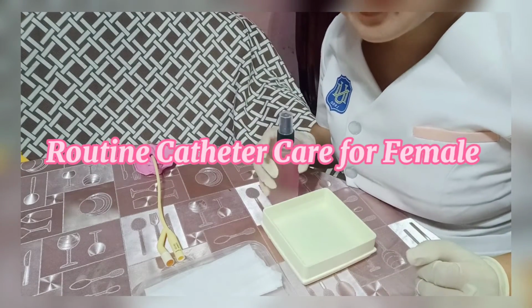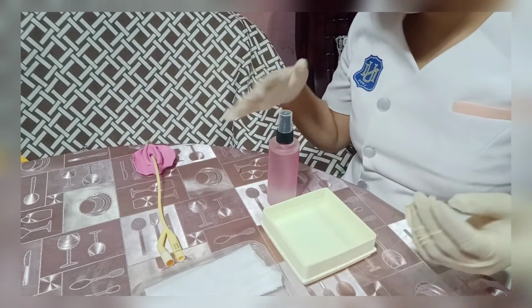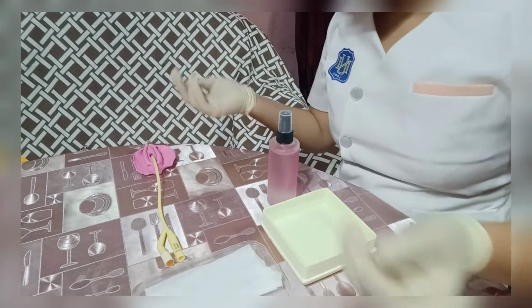Prior to performing the procedure, we have to check if the catheter is intact or not.